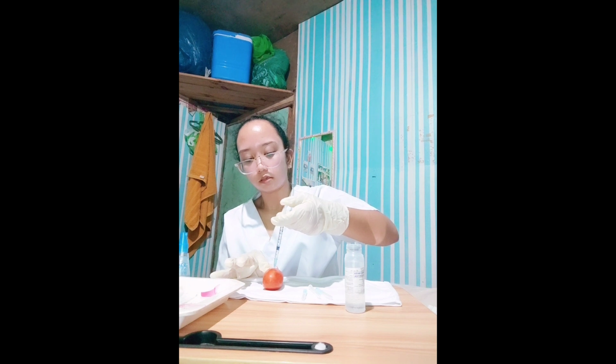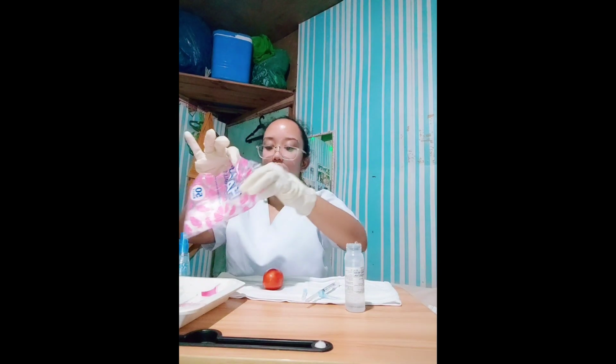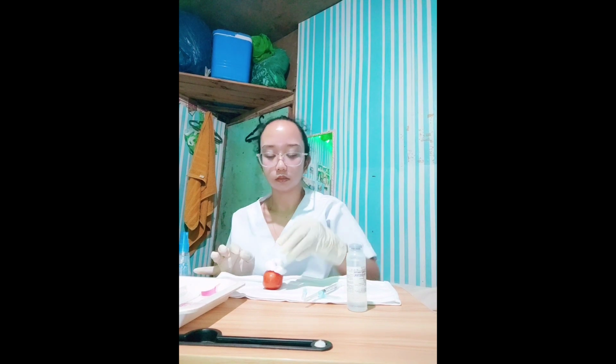And withdraw. Cotton swab. So after this, we will assist the client to a comfortable position, and appropriate positions promote relaxation.